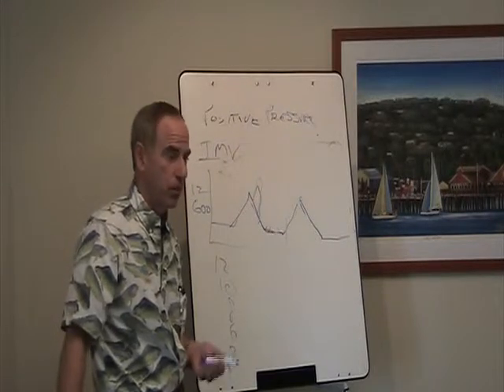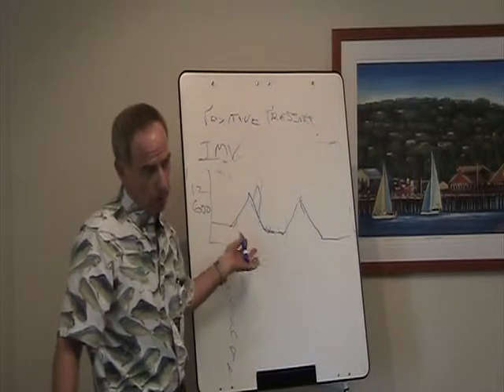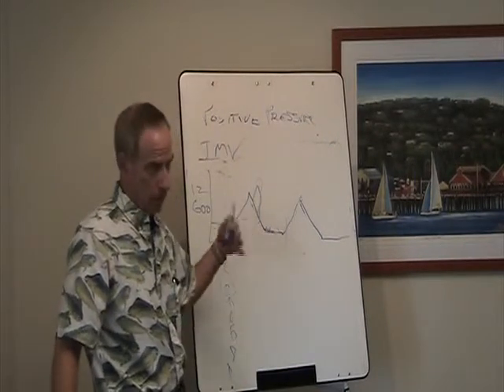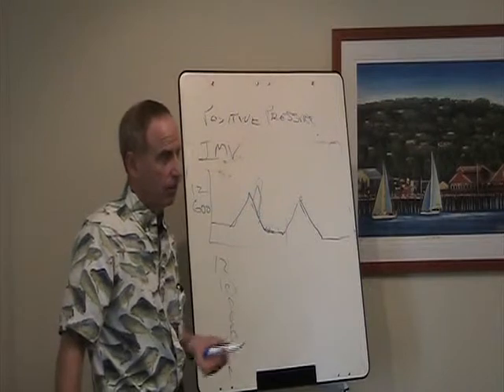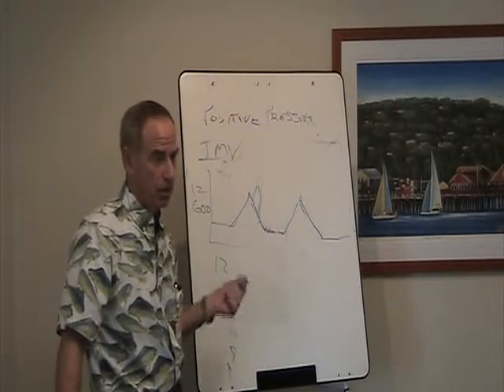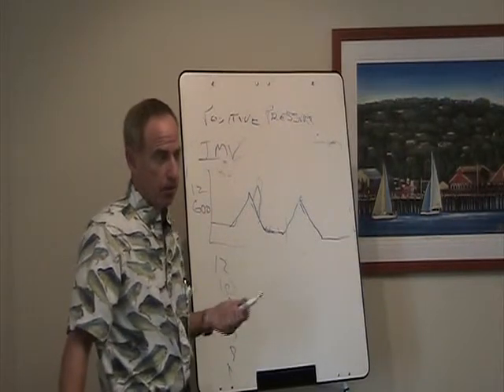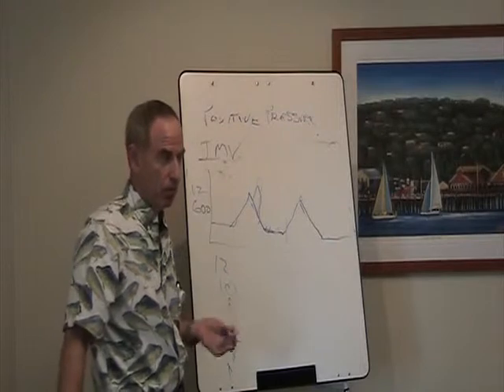It wasn't a big problem, and most people that were put in an IMV mode back then, within a day or so, just gradually adjusted to the ventilator and they synchronized pretty well. But the ventilator companies thought that this was a good way to make money. So they developed synchronized IMV, which is what we have now.